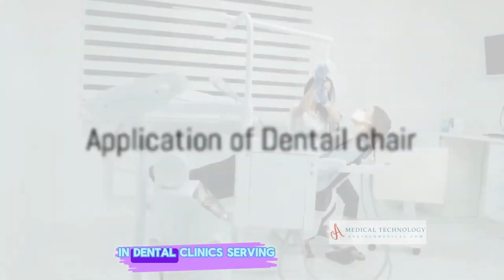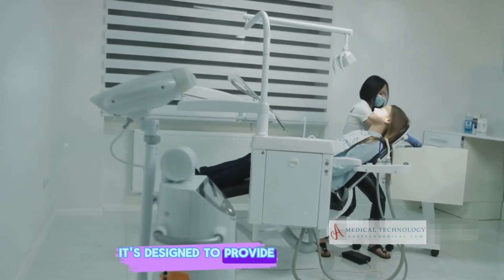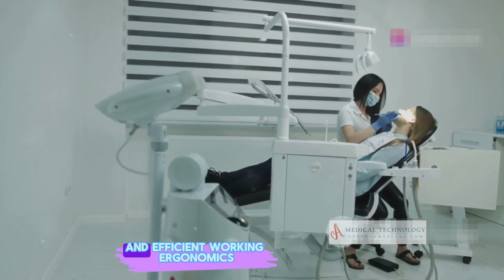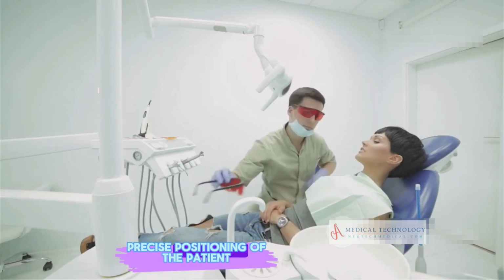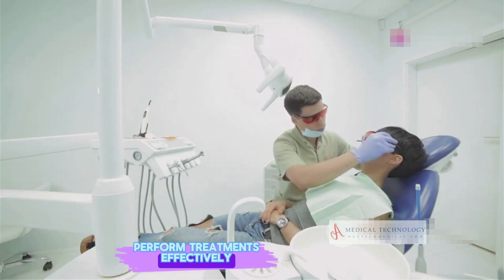The dental chair is a fundamental piece of equipment in dental clinics serving multiple medical applications. It's designed to provide optimal access to the patient's oral cavity for various dental procedures, ensuring both patient comfort and efficient working ergonomics for dental professionals. The chair allows for precise positioning of the patient, which is crucial for the dentist to perform treatments effectively.